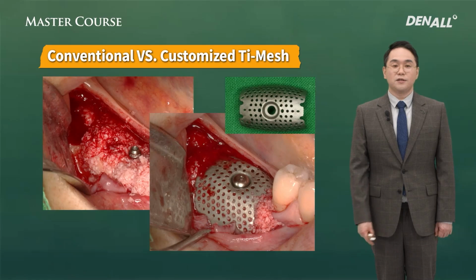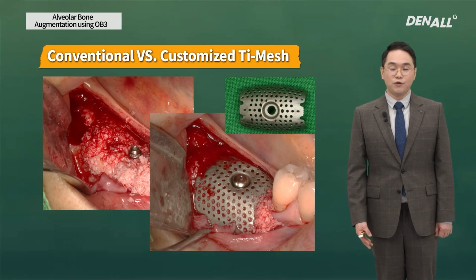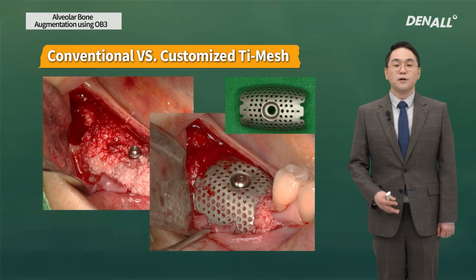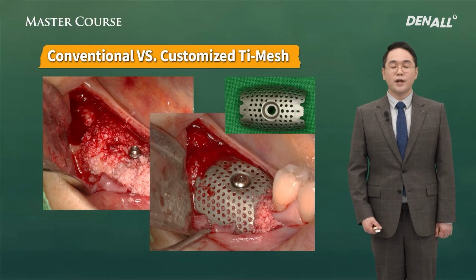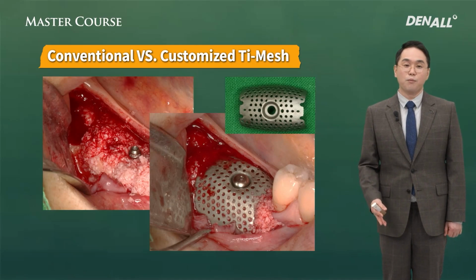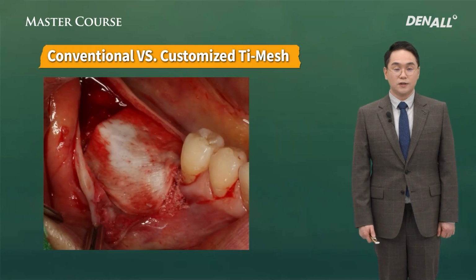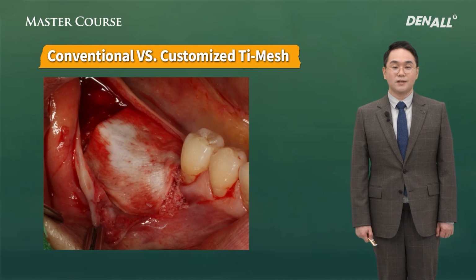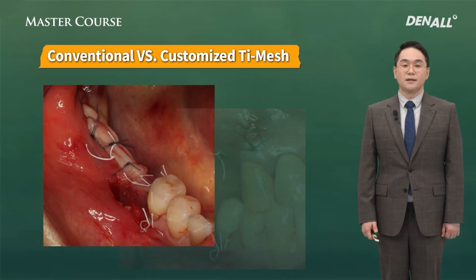After that, as you can see, the patient's gingiva biotype is very thin, so there is a risk of exposure. Just like the OS-Builder, the Jawbuilder is preformed and there is no line angle area, so less exposure risk, but if the gingiva biotype is thin, then edges can be exposed. To minimize it, the OS-guide membrane covers the site. Next, the primary closure.